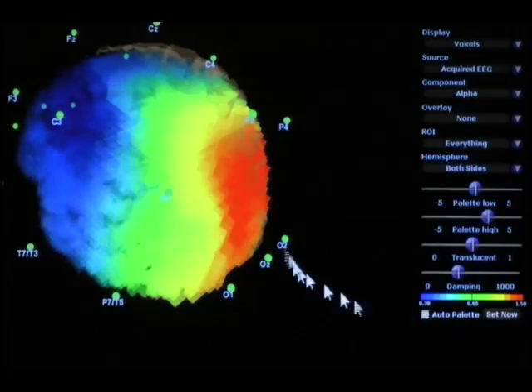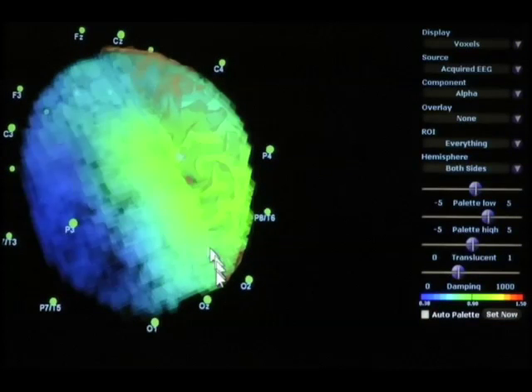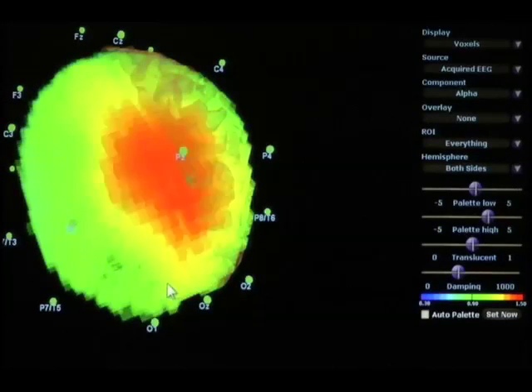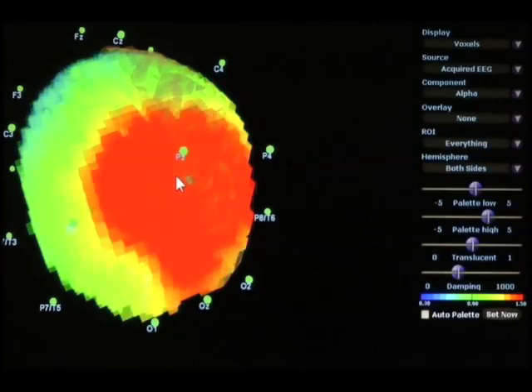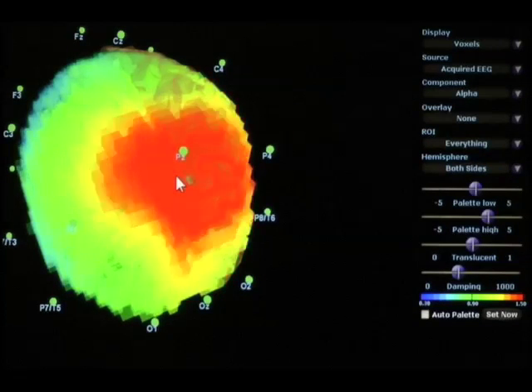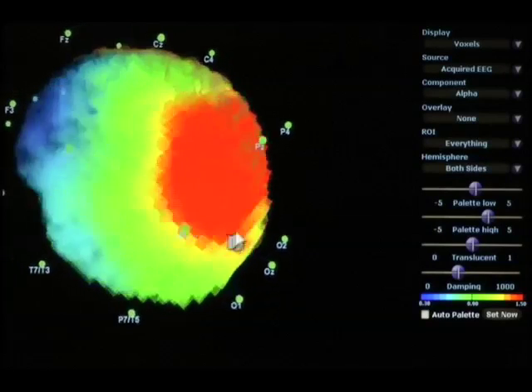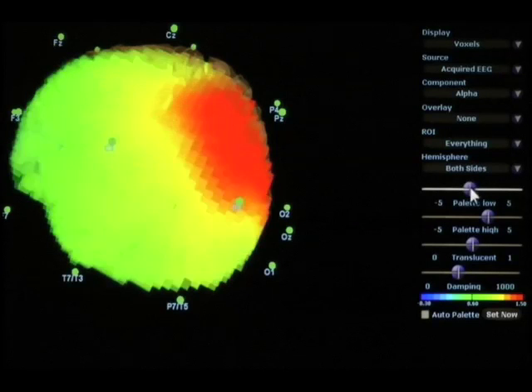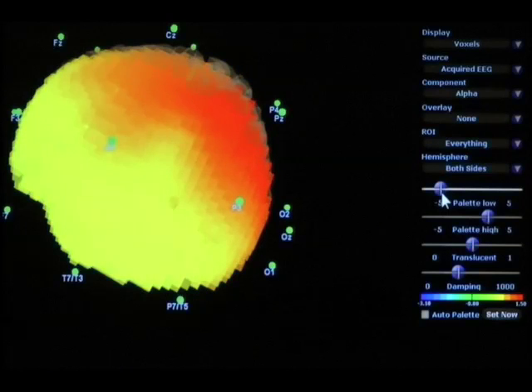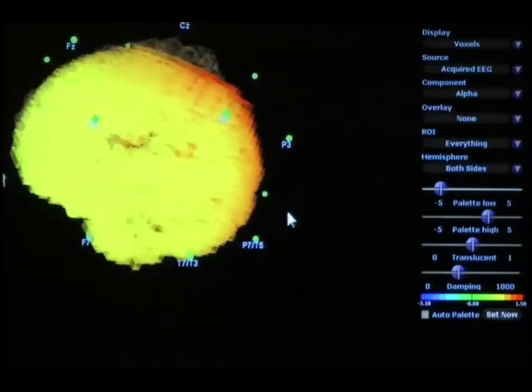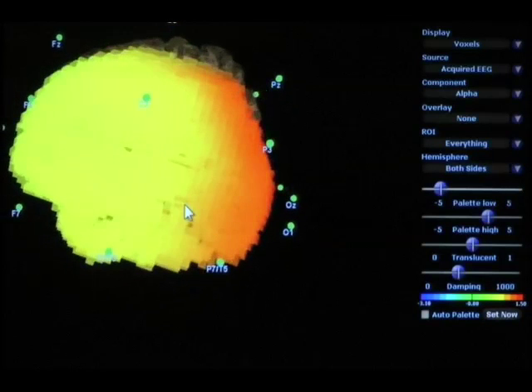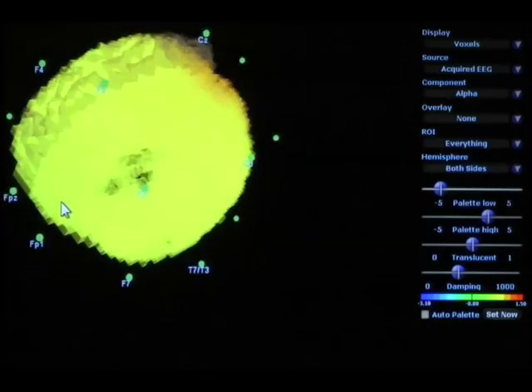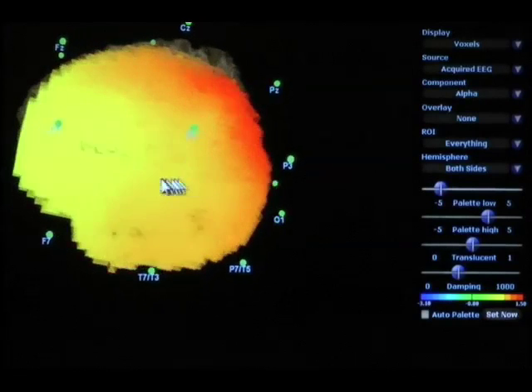I'm going to turn off auto palette right now. Now you'll see the signals are starting to move a little more slowly. There we have a burst in the posterior and then it comes and then it might fade. Let me show what happens as we adjust the palette manually. If I take palette low and slide it down, we see a lot of the graph now becomes yellow and orange and red. That's because the minimum value we have chosen is now very low and everything is above that value.